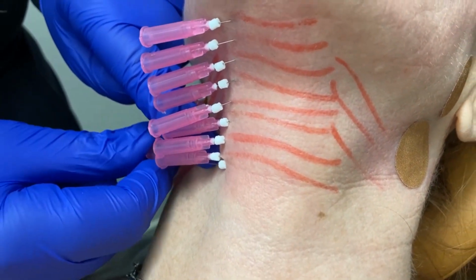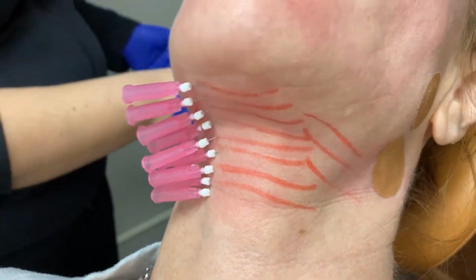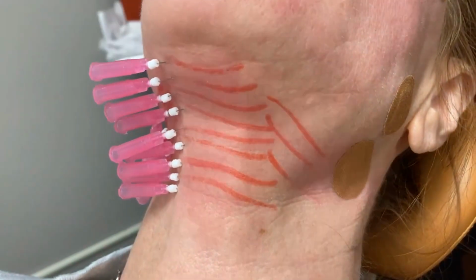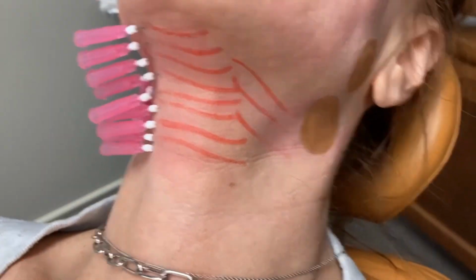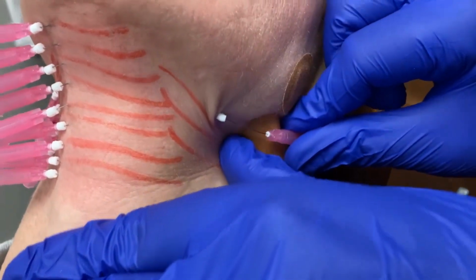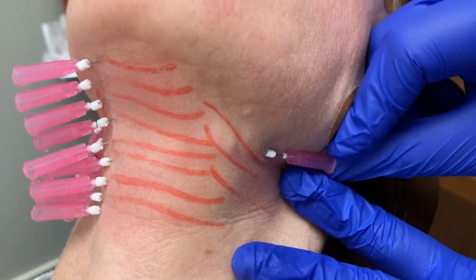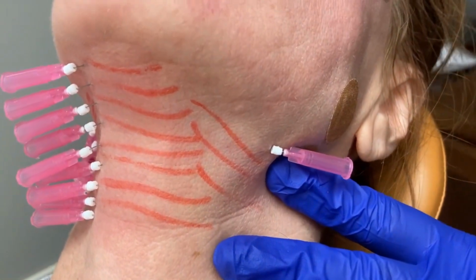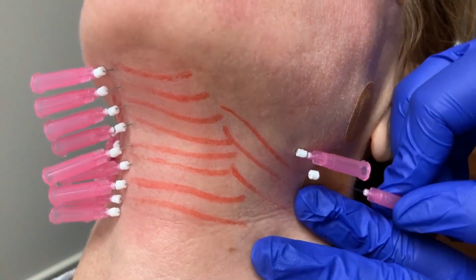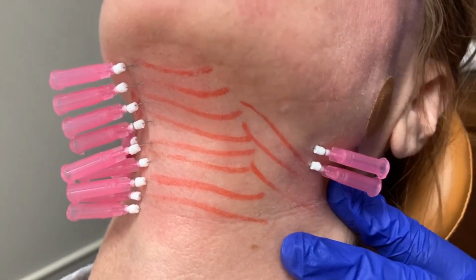They have got a special polymer coating on their PDO threads, which means that they take a little longer to break down. And the longer it takes for them to break down, the more collagen the body produces here. And also, it's a minimum amount of threads. Now, this may look like a little bit more than usual because it's a very long and wide area that we're doing. We're doing a lot in this area, so you're seeing a lot of threads.